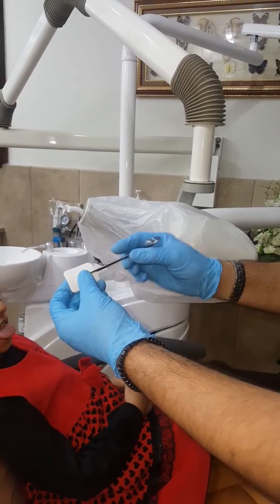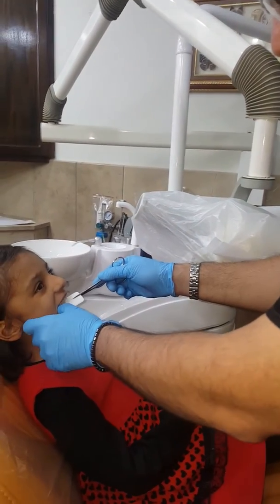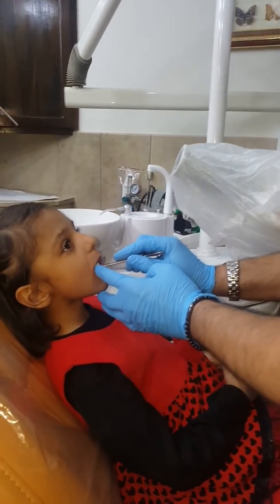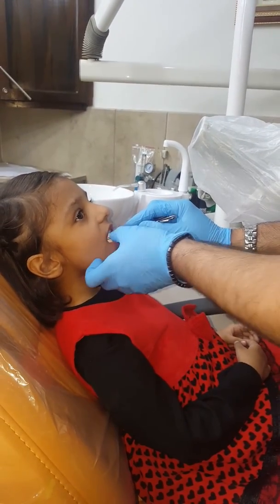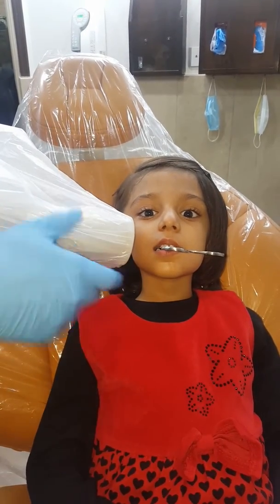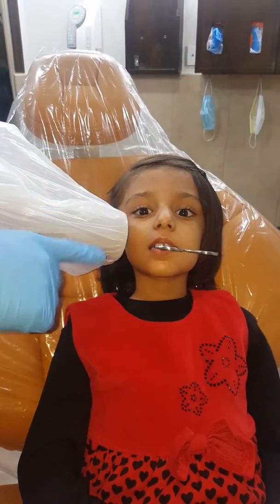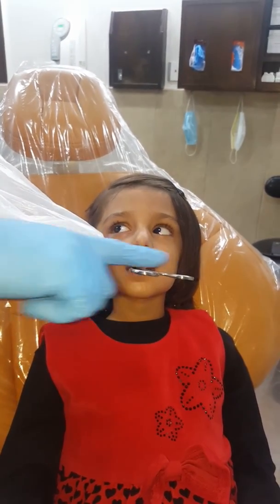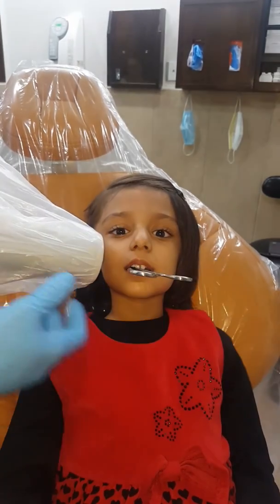Open and place it inside, and close down. The patient closes down, and make sure you have them close on the teeth. When it is placed, you want to make sure that your cone is exactly perpendicular to the film but parallel to the long axis of the bite wings on the hemostat.